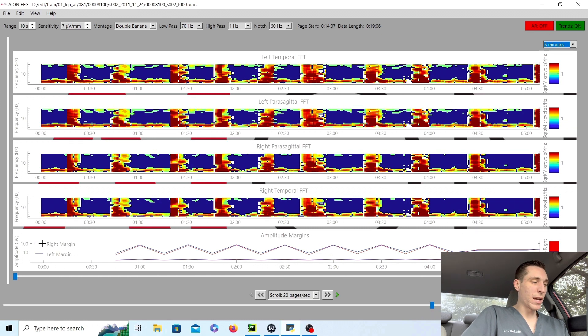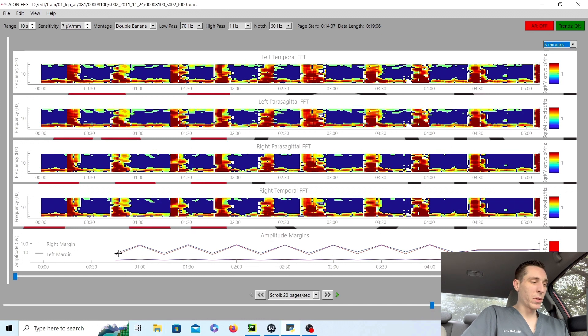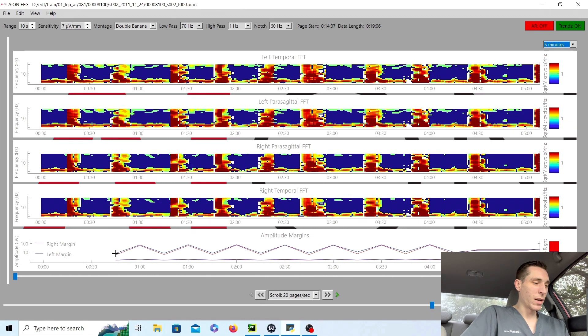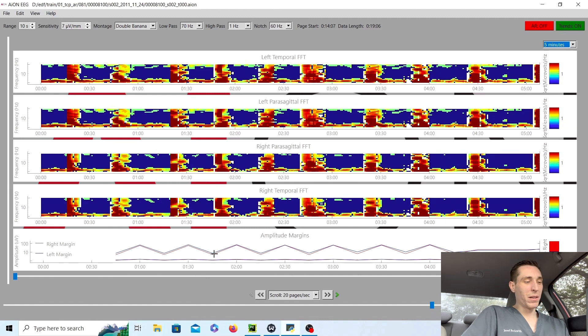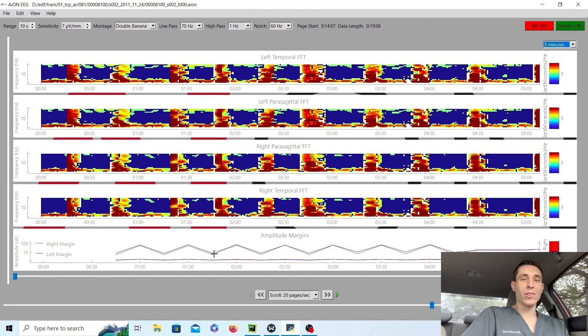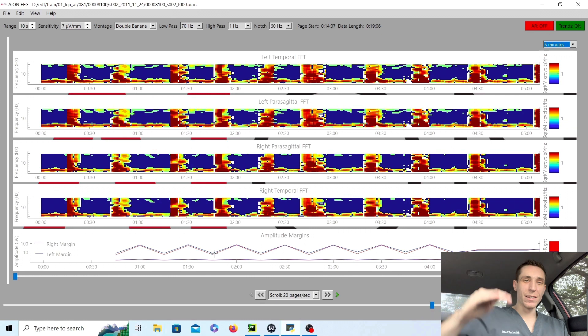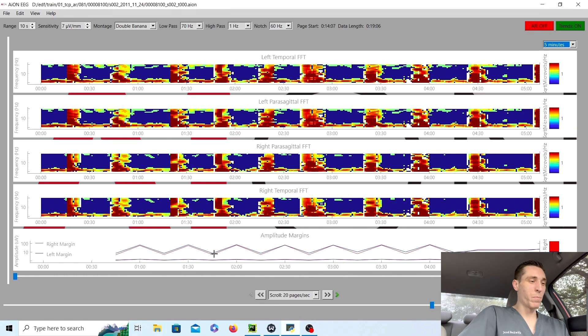So the red line is the right side. The blue line is the left side. And they essentially overlap. But as you can see, it starts out at around an average of 10 microvolts. And then it shoots all the way up to 100. And then it goes back down to 10. And then it goes all the way up to 100. Then all the way back down to 10. There would be no other reason for such a sharp increase and decrease in average amplitude other than a burst suppression pattern.